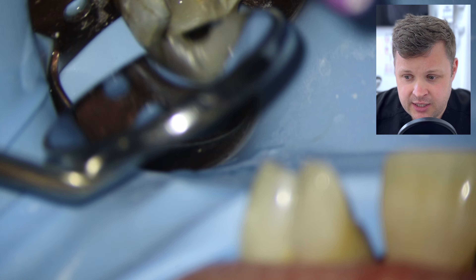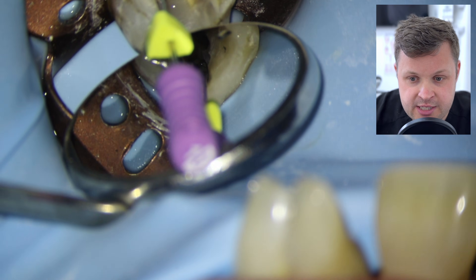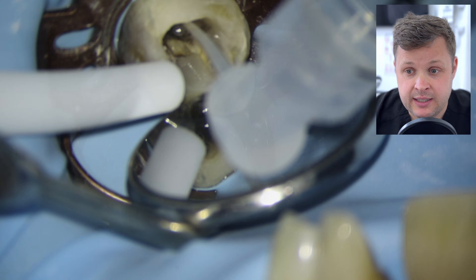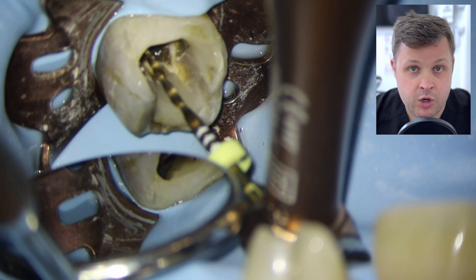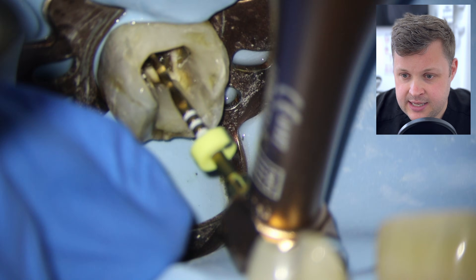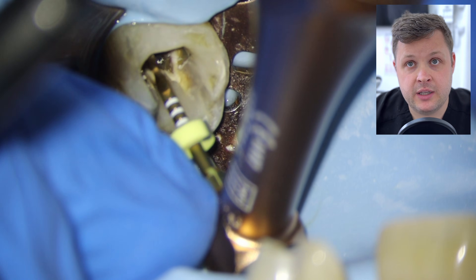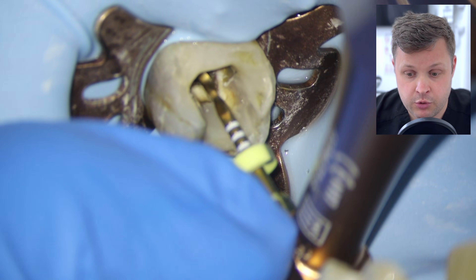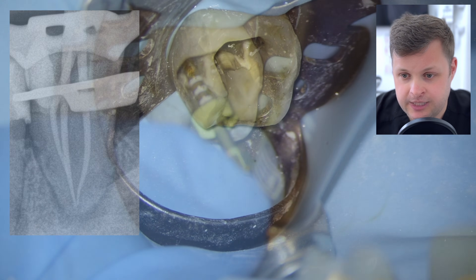Eventually, after carefully removing enough composite filling, we finally find the orifice with the size 10 D-finder. The protocol is the same: shape with HyFlex 15 glide path file, lots of irrigation, then shape with the size 20/05 WaveOne Gold file. It's a bit tough to get to length. I don't want to open this canal space too much since all canals join into one anyway — using a size 20 here is to conserve dentin rather than unnecessarily removing more with a size 25.